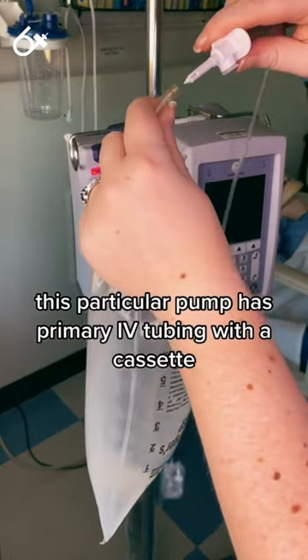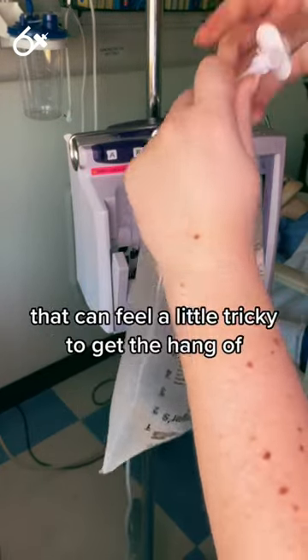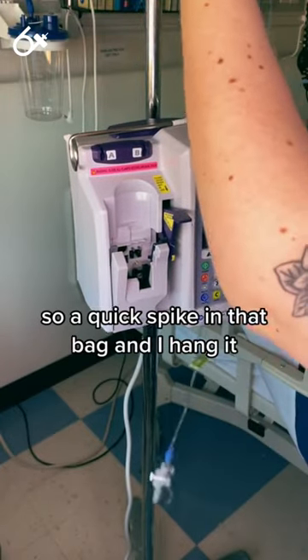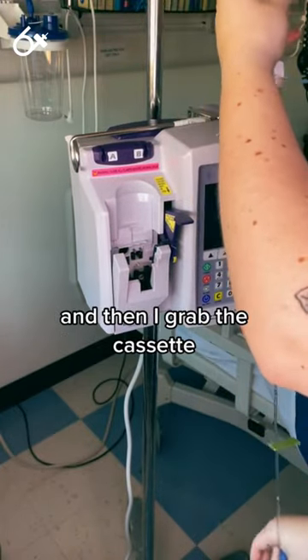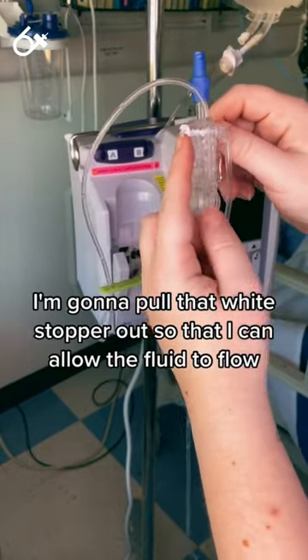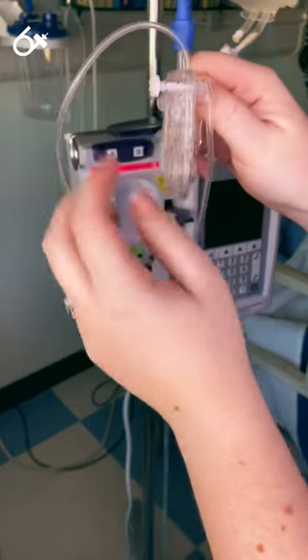This particular pump has primary IV tubing with a cassette that can feel a little tricky to get the hang of. So a quick spike in that bag and I hang it, and then I grab the cassette. I'm going to pull that white stopper out so that I can allow the fluid to flow.